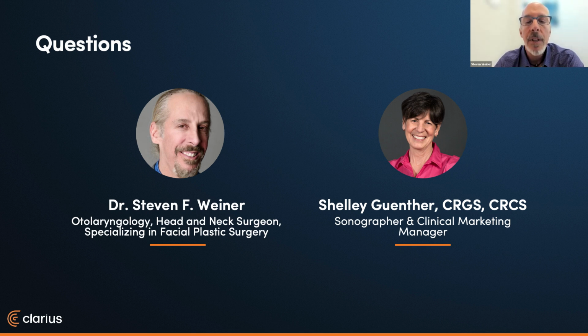I didn't know you had an L17. I think it's L7. Okay, the L7 is not ideal for the face. It doesn't have enough resolution, so I wouldn't use the L7. I don't think they have an aesthetics mode.